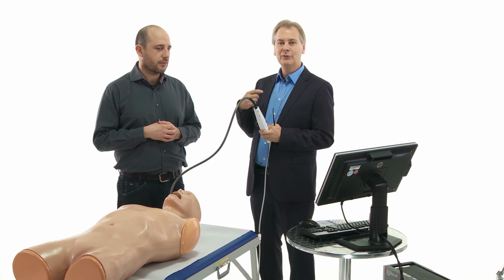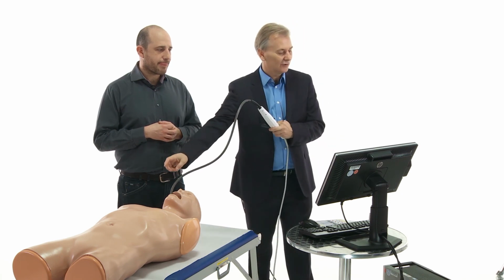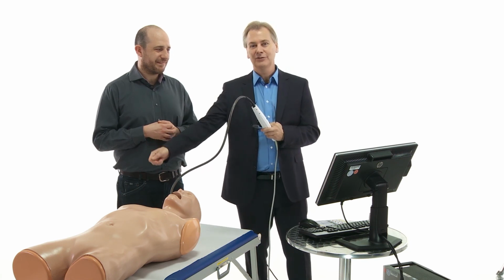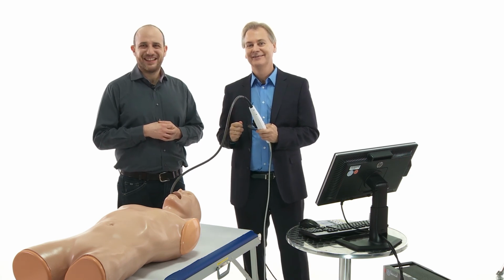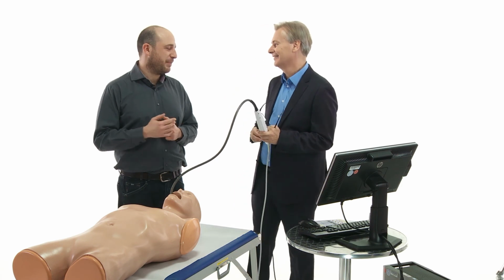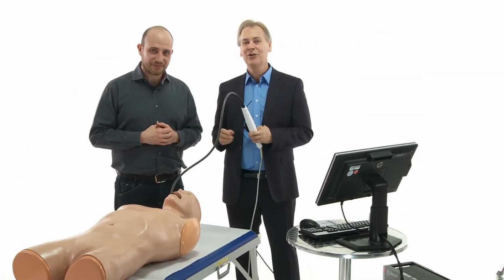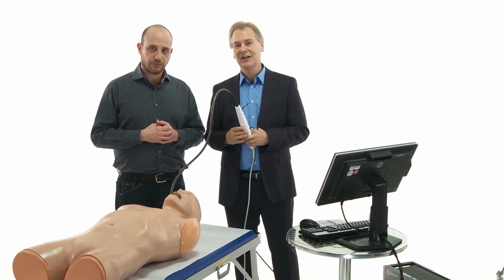One little tip that I would like to give you, something you have to be aware of: when you're looking at the machine and trying to grab the transducer, watch out that you're not grabbing onto the tube and pulling that out. This is something you certainly don't want to have. Yeah, we don't want to extubate the patients, because we will have other problems than cardiac problems. Yes. Okay, so this is the introduction of the probe. We will then go to the different cut planes. We want to show you what you see when you have the probe inside.